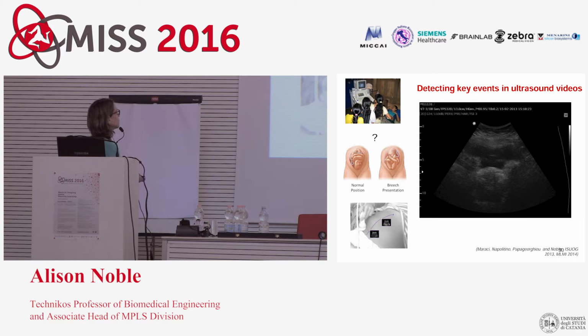It started out by looking at breech, because we thought that was a problem that we could address, and you could imagine you could solve that one. But we've also moved on now to try and understand what else we can extract from videos of this kind, because it's so simple to use that anybody anywhere could use it in the context of making decisions in obstetrics. So the video I showed you before was one of those examples: as you go through the scan, that's the head, and then you're going through the body, and you're seeing the limbs.